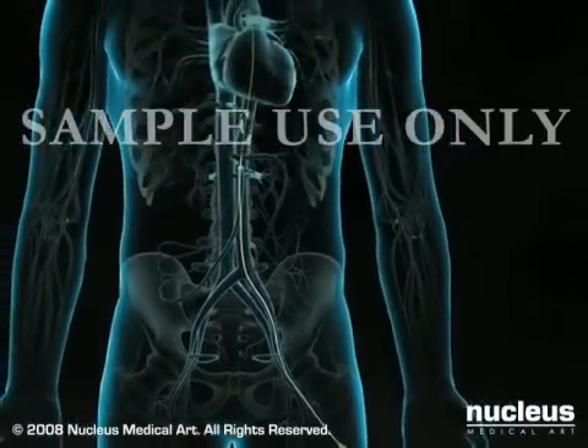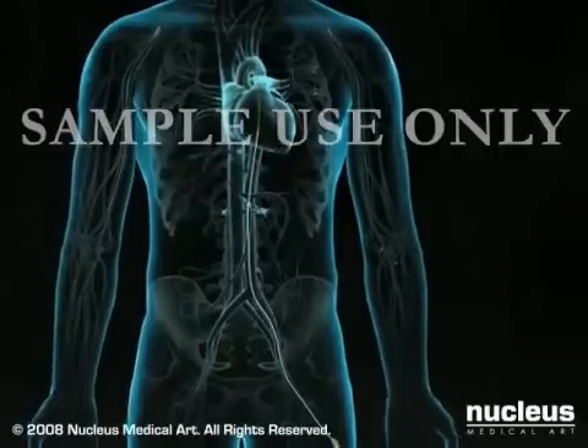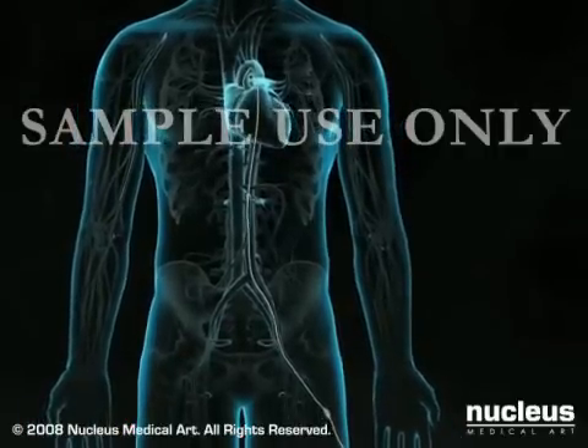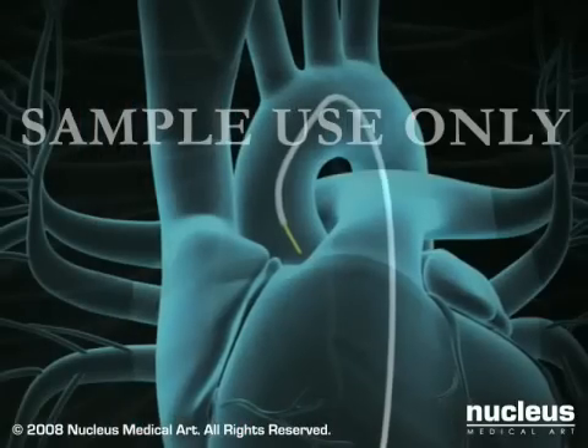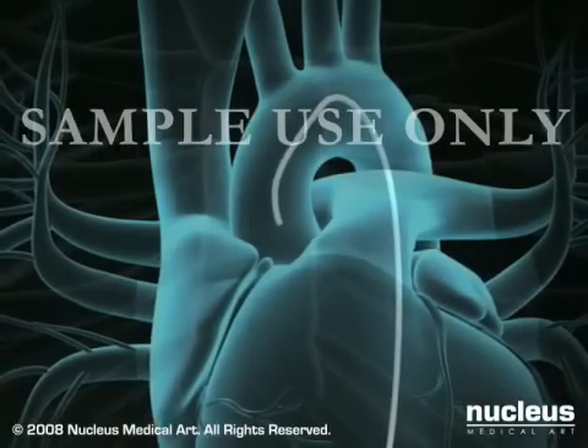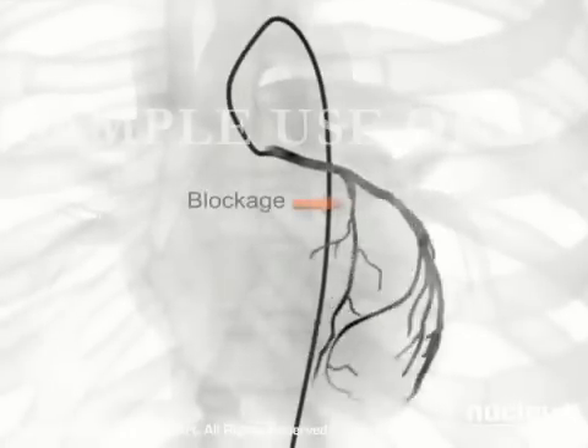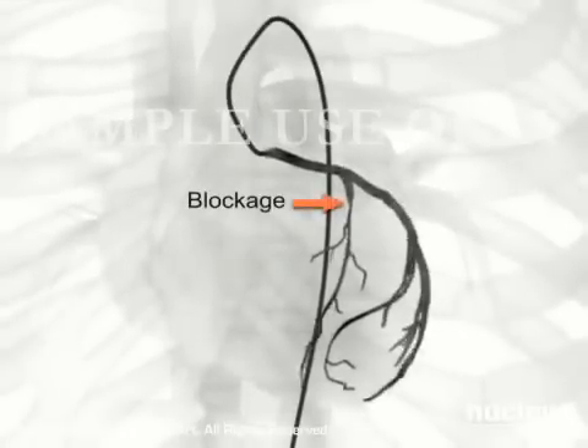You may feel pressure as the wire and sheath are inserted through the groin and pushed through the artery, but you will not feel their movement inside your arteries. At this point, your doctor will remove the guide wire, position the tip of the catheter just inside the coronary artery to be treated, and inject a special dye. The dye allows the fluoroscope to take X-ray images, called angiograms, of the artery's interior. Any blockages will be clearly identified as the arteries fill with the dye.